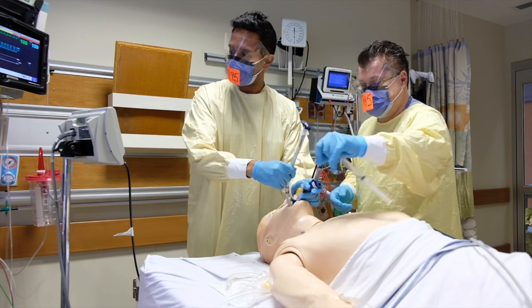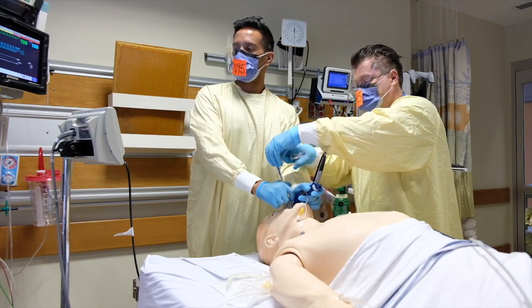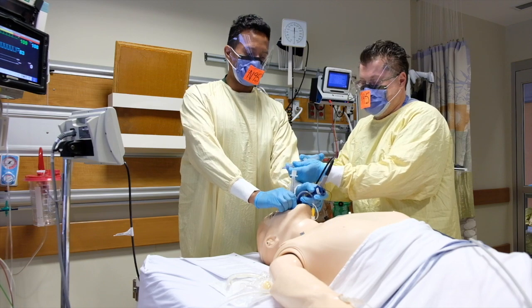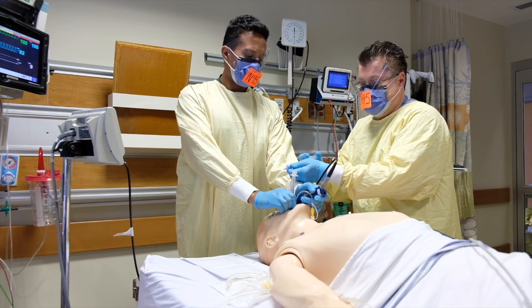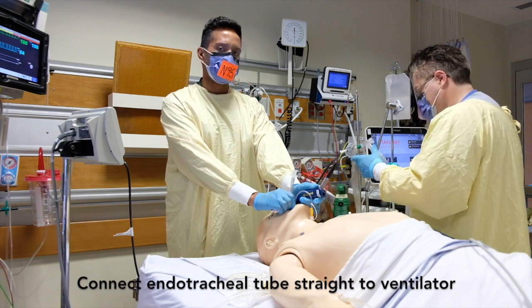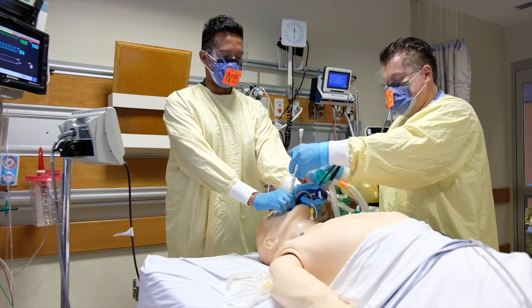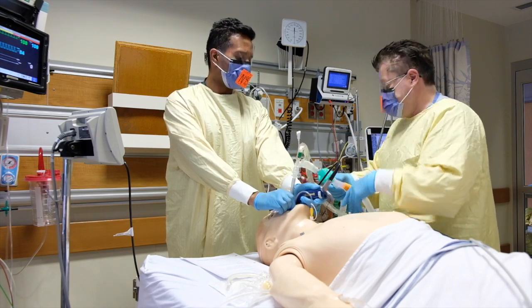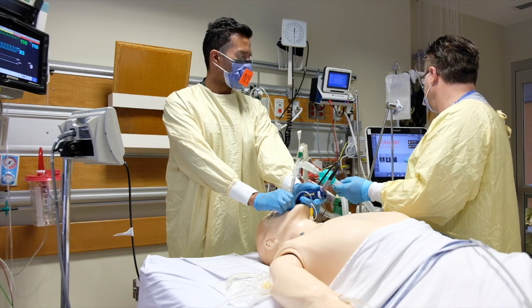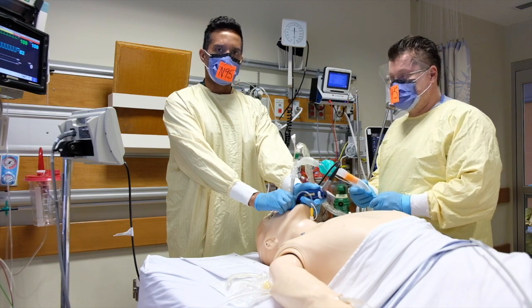What we're going to do is we're going to go straight onto the vent. When we're done, you can take the stylet out, please. Thank you. And again, we have not bagged. We're going to put the cuff up, and we're not going to go onto the bagger. We're going to go straight onto the ventilator, and there's end-tidal CO2 hooked up on the ventilator. And then we're going to turn the ventilator on. This minimizes the number of disconnections in the circuit. And then the patient will have been intubated.